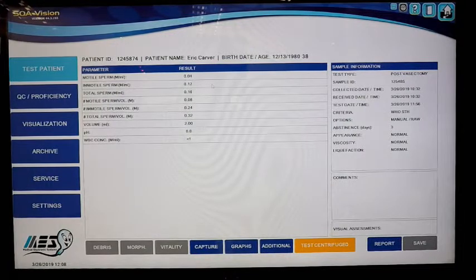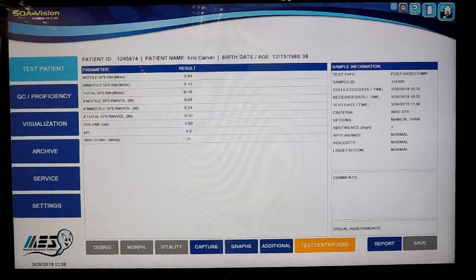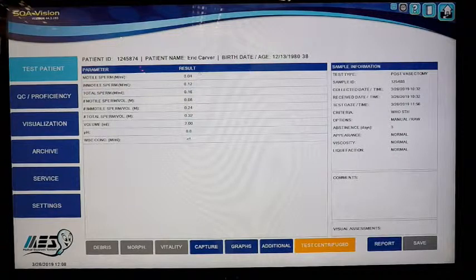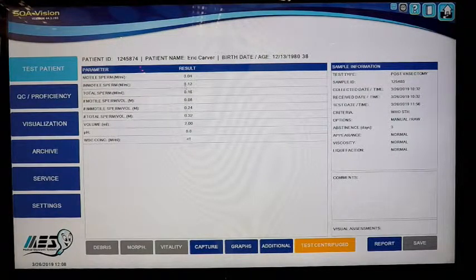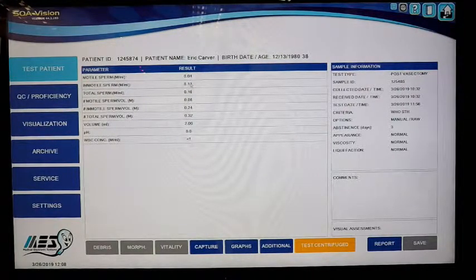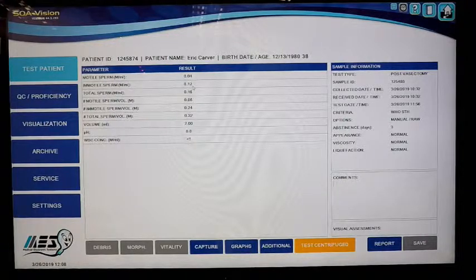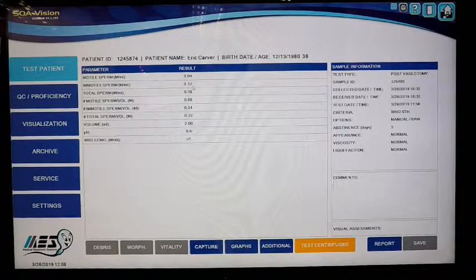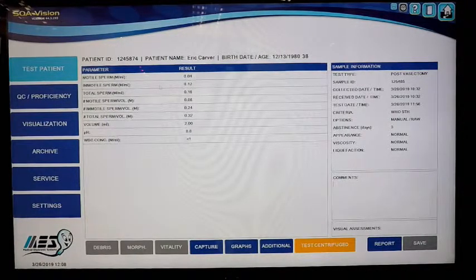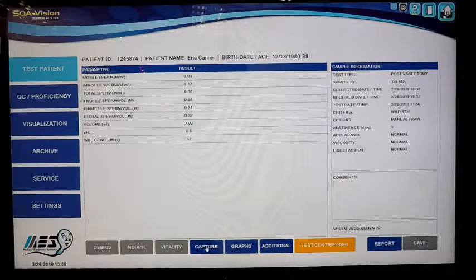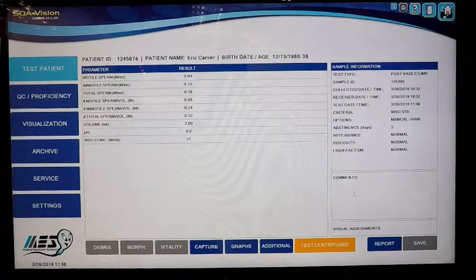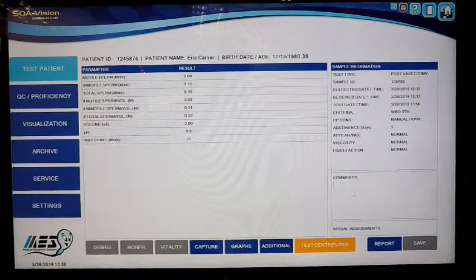In that situation, you're just going to report present or absent. Obviously, there probably wouldn't be any motile at that point, but you'd still get your immotile. Rather than reporting this quantitative value, you could just say present. You have the option to go back, capture an image if you want, and put in comments based on what you saw.